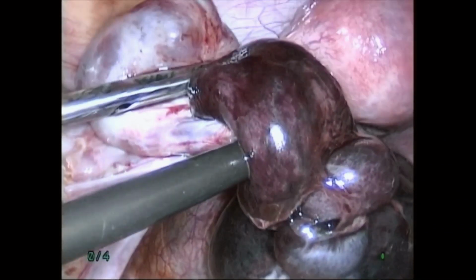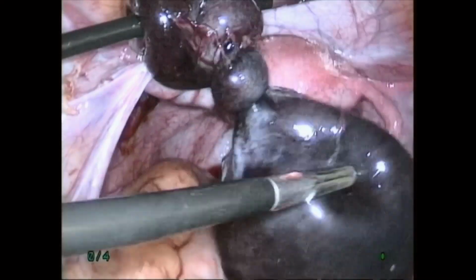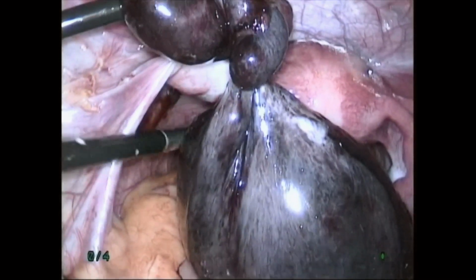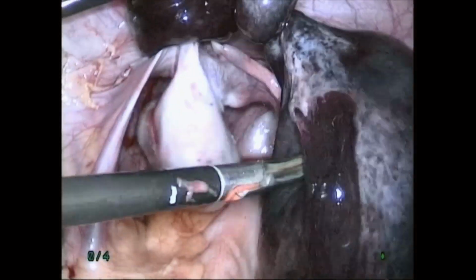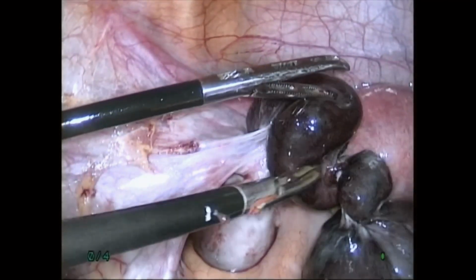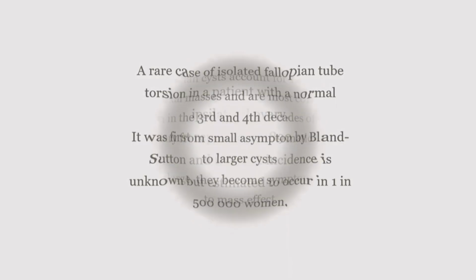There was no way to save such fallopian tubes. Detortion is being performed here. So many torsions. And the tube was removed.